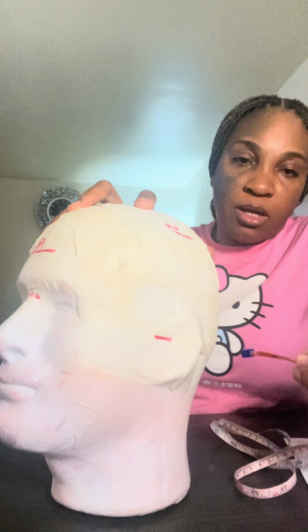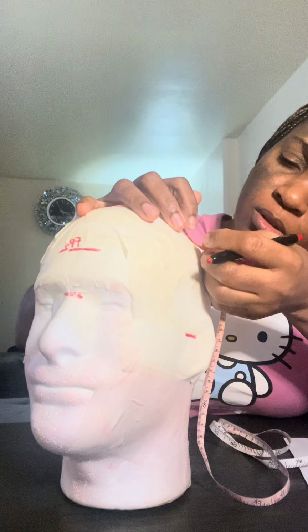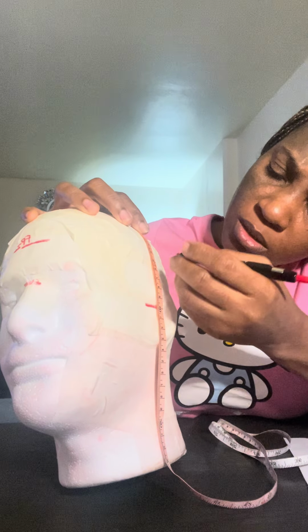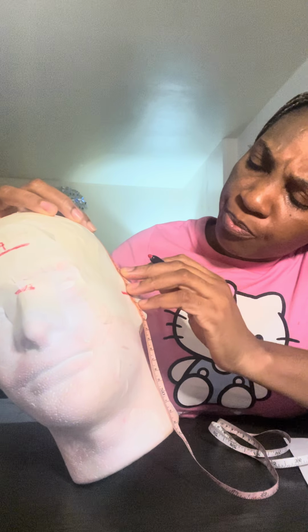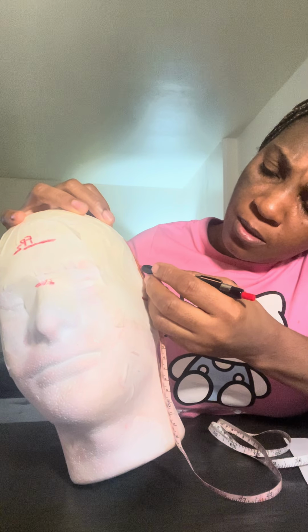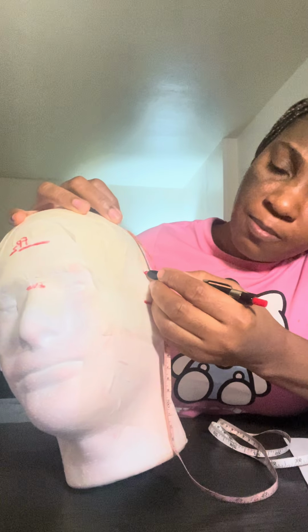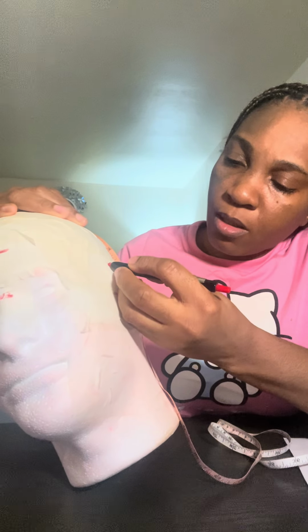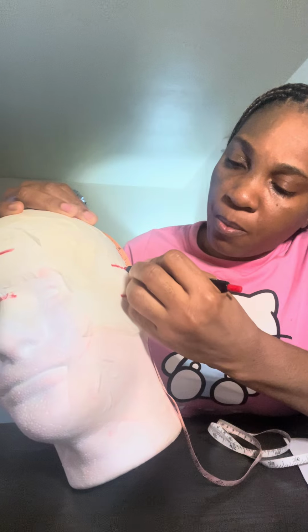From my C4 now, going to my preauricular right, 20%, which is 6.8. This is my T4.